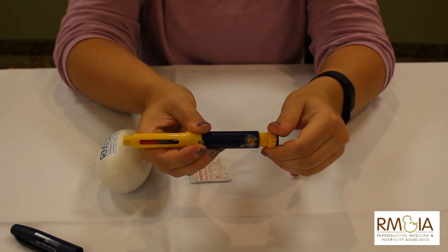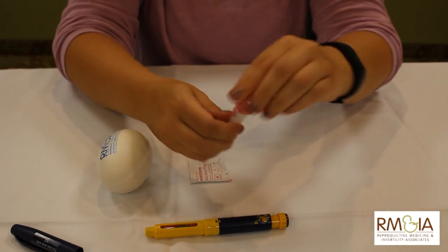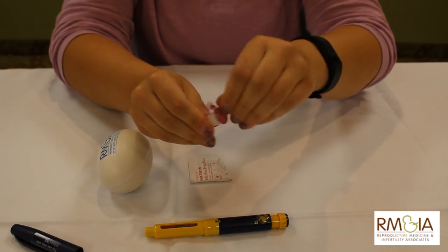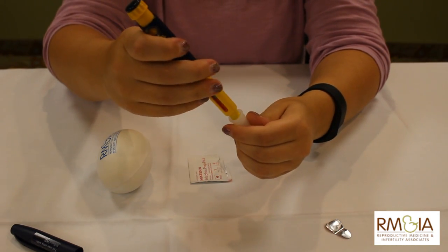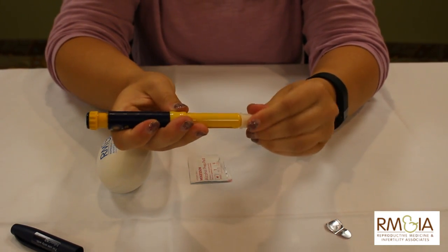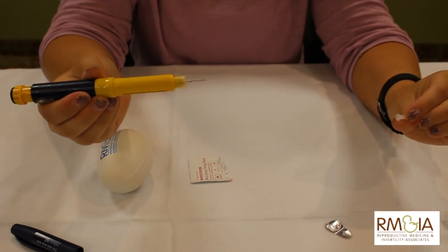Then you'll again draw up to the dose we tell you to, and then we'll get our needle ready. Pull off the paper top and place the pen just like that and screw your needle on. Take off the cover and the safety piece.